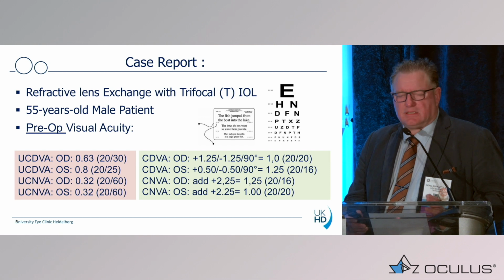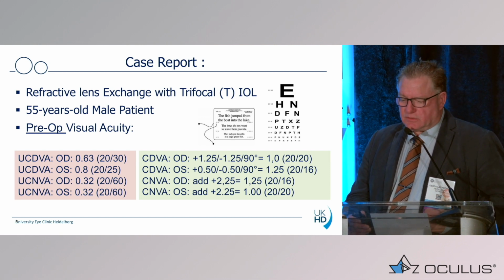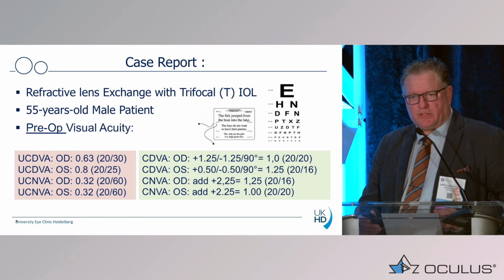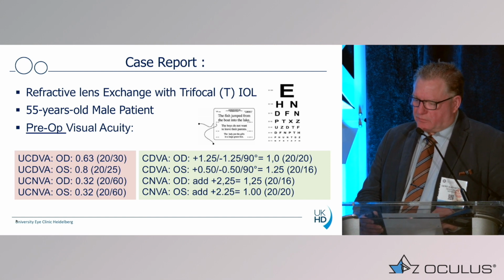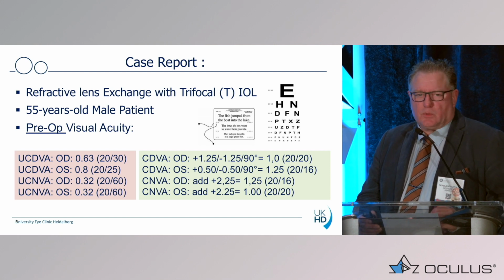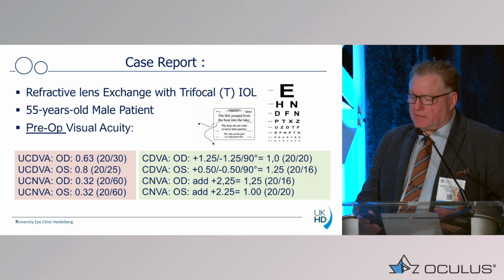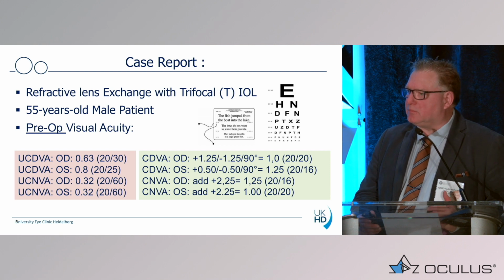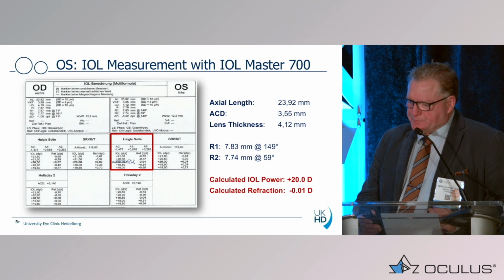And you may be hesitant even to touch an eye like this, but the reality is that the patient runs around with the uncorrected visual acuity and is driving car and everything with that. So if you want to touch this kind of patient, you have to reach excellent results. You cannot end up with plus minus 3/4 of a diopter of astigmatism or hyperopia when you just do your normal IOL calculation. So our routine workup normally would be that we use the IOL Master 700.